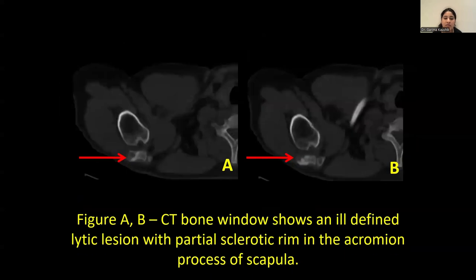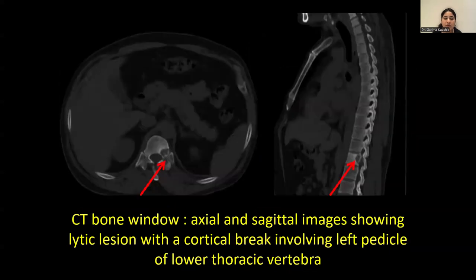CT bone window shows an ill-defined lytic lesion with partial sclerotic rim in the acromion process of the scapula. CT bone window also revealed axial and sagittal images showing a lytic lesion with a cortical break involving the left vertebral body of a lower thoracic vertebra.